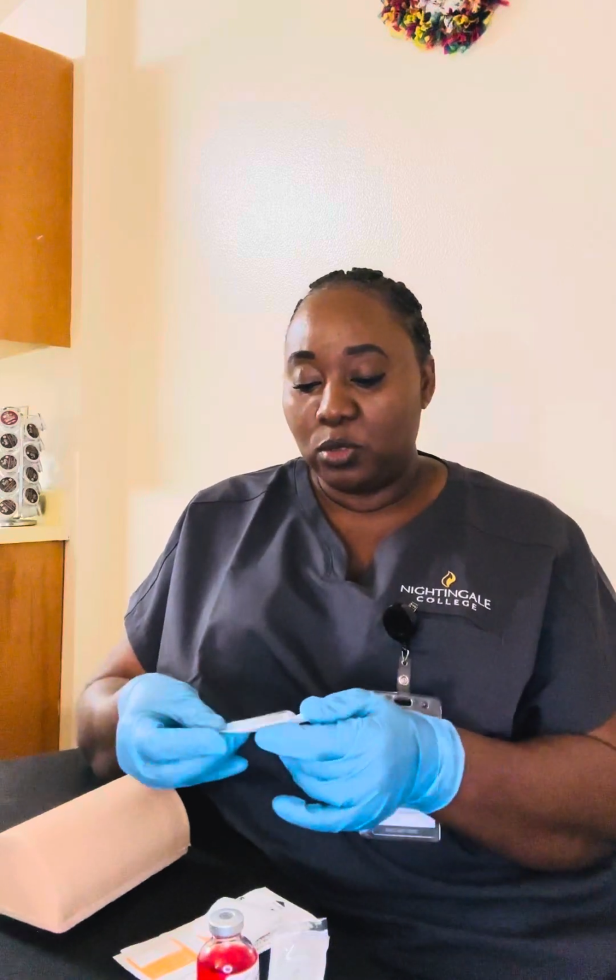First thing I'm going to do is check my needle. Right now I'm using the 1 ml syringe. A normal subcutaneous needle is actually 25 G by 5/8 inch, but here I have a 25 G by 1 inch, assuming the size of the patient requires a 1 inch needle. So for this, I'm going to remove the needle.